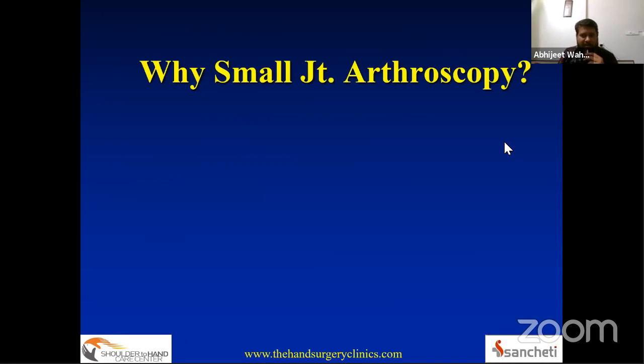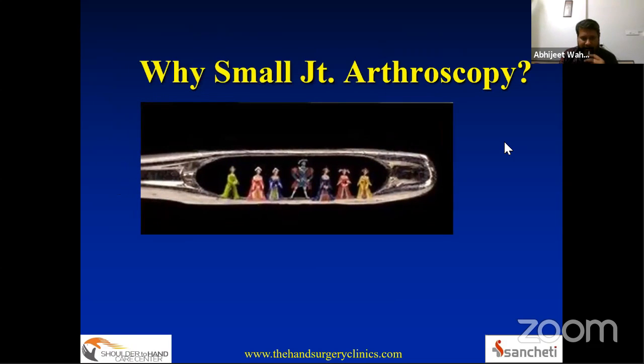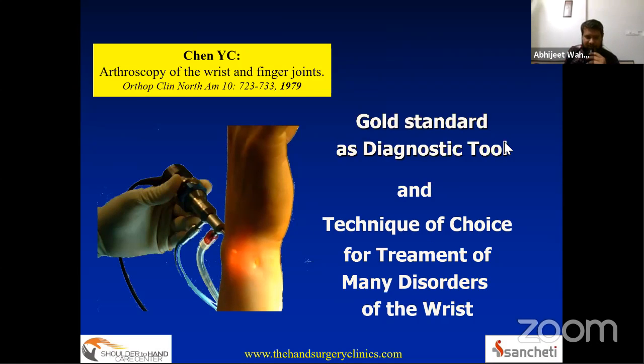So why do we talk about small joint arthroscopy? To plead my case, I would like your attention to this slide and this picture, which shows a man trying to peep into the eye of the needle. If you zoom into the eye of the needle, you'll see this beautiful craftsmanship in that little eye. Arthroscopy gives you the opportunity to look into joints with high resolution and high definition. It is like performing microsurgery within a joint using these specialized instruments.